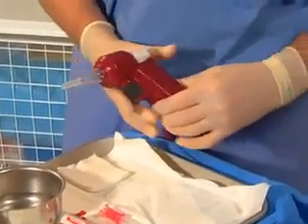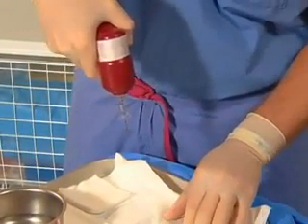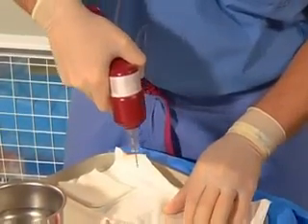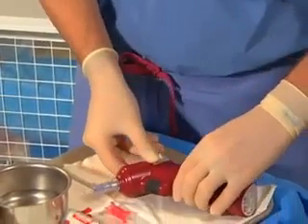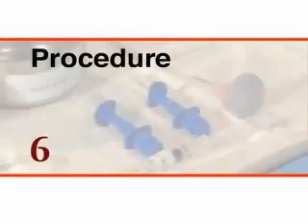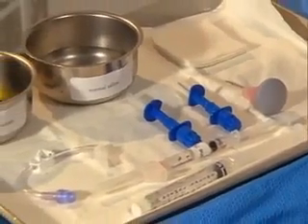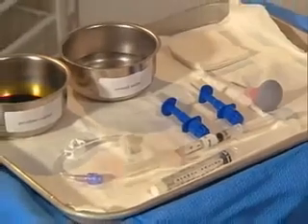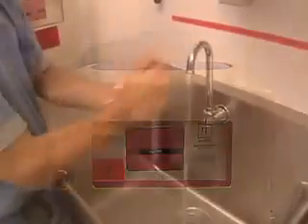The battery-powered driver and cutting needle facilitate penetration of the bony cortex, while the operator can control the depth of insertion by increasing or decreasing the pressure applied and by changing the length of time the drill trigger is depressed. Place all equipment on an open surface that is readily accessible. Make sure that approved biohazard sharps receptacles are nearby, since intraosseous cannulas are not equipped with retractable safety needles.